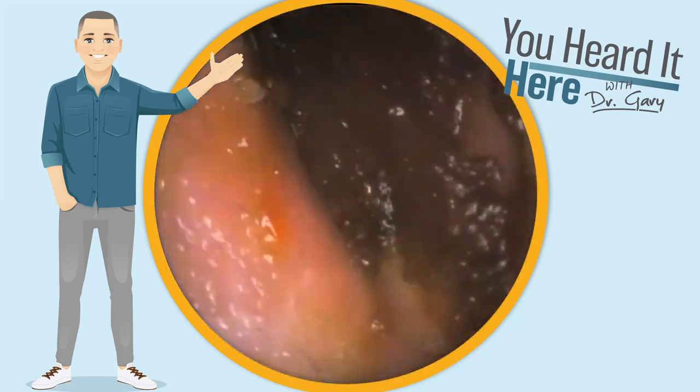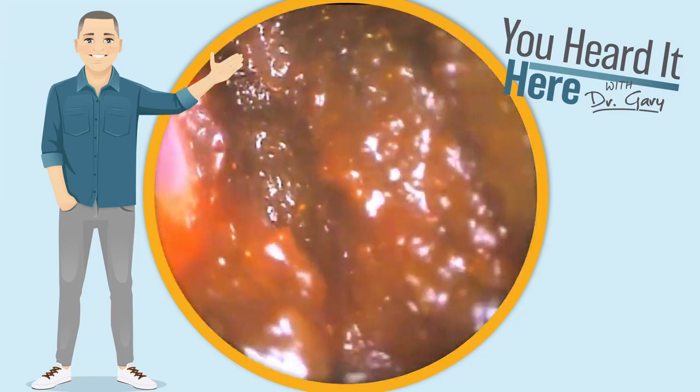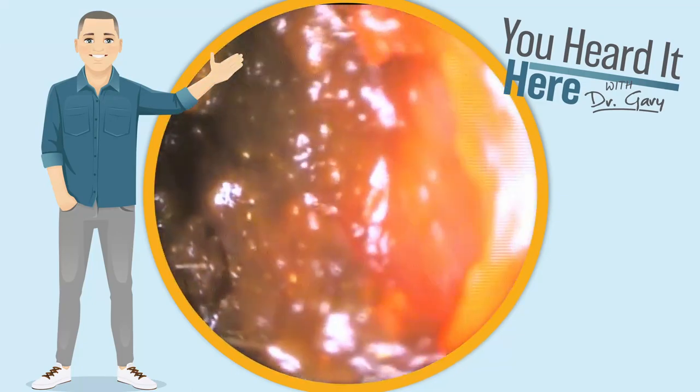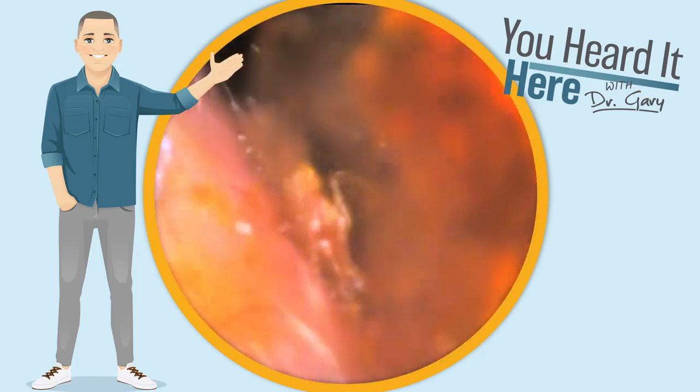As we use the curette here to get the majority of this wax out of the way, you can see how it just kind of keeps on going — the curette is going right through the wax. We're going to try to use some irrigation.